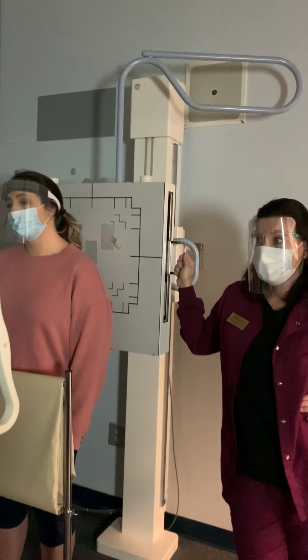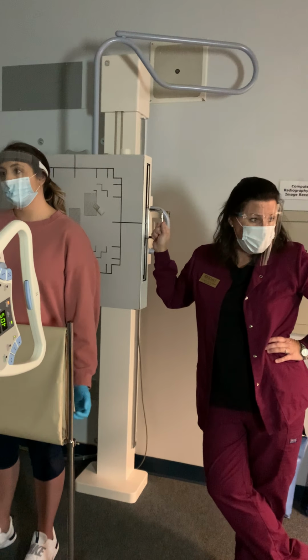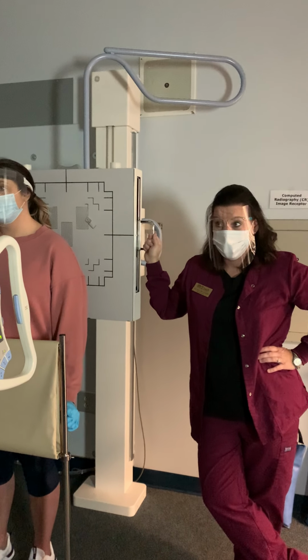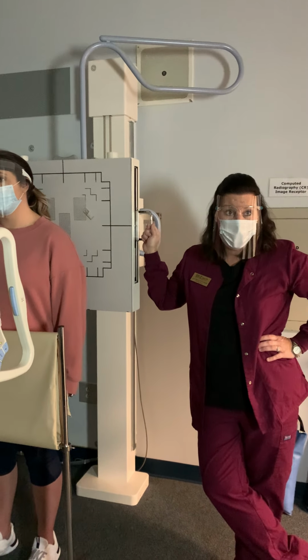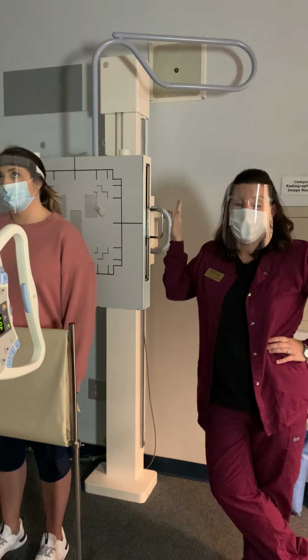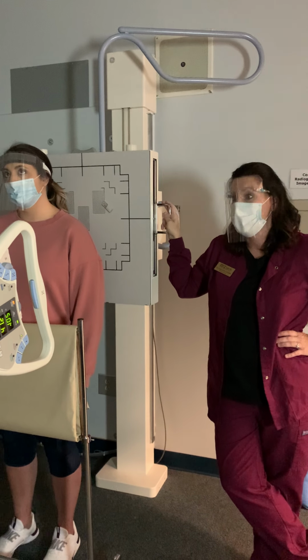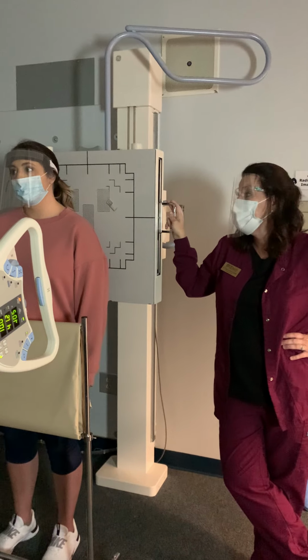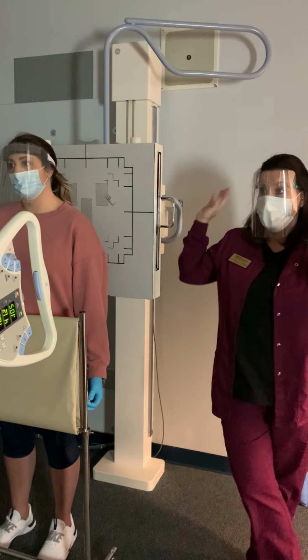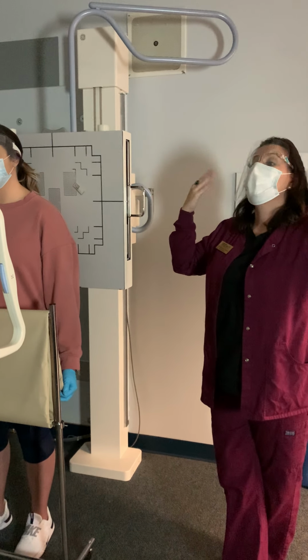Here's the kicker with this. AP and PA were what? Breathing instructions. Expiration, right? The axials, AP and PA, inspiration. And that is what gets students every time. So I'm telling you this to make a note, highlight it, circle it, star it, whatever you want to do to it, to make sure it draws your attention. AP and PA is expiration. AP and PA axials are done on inspiration.